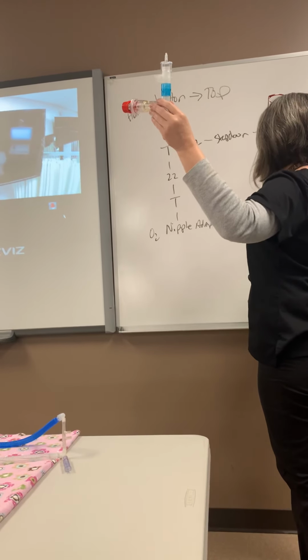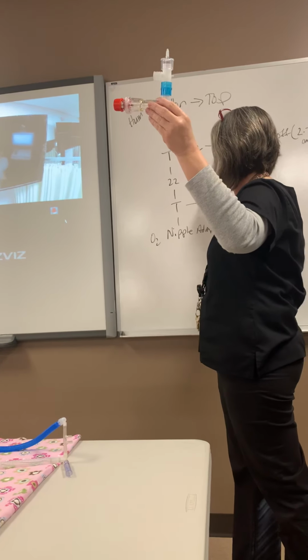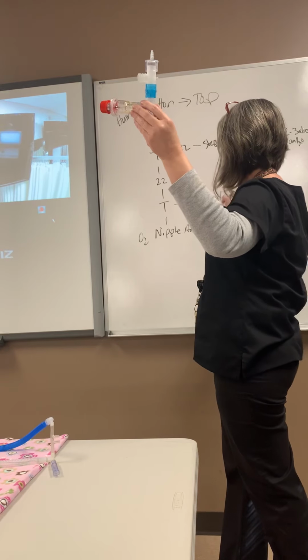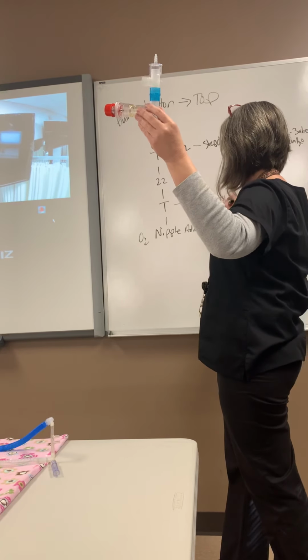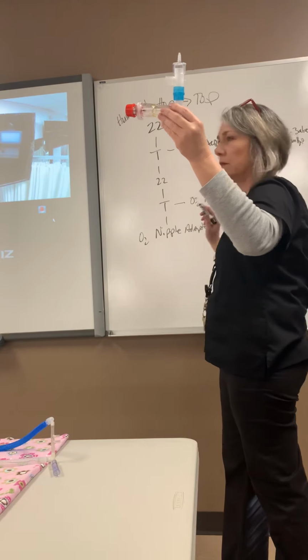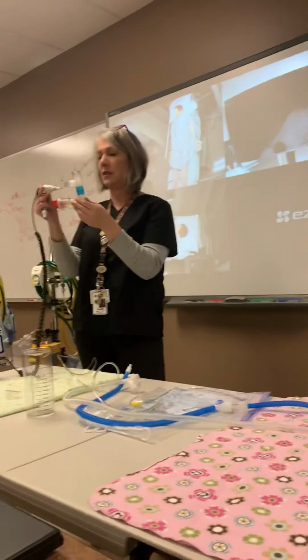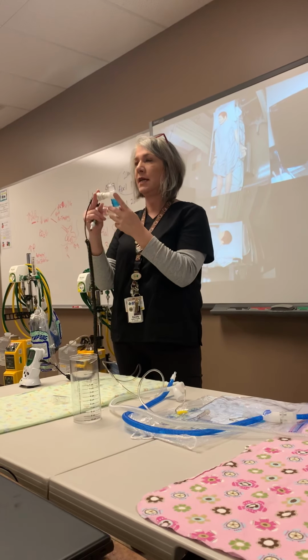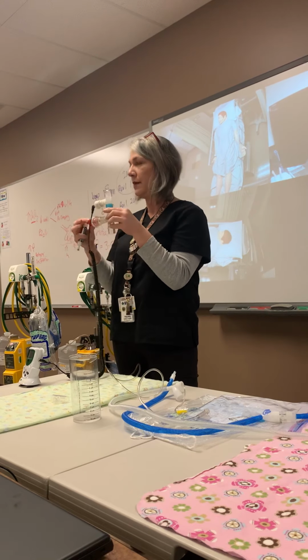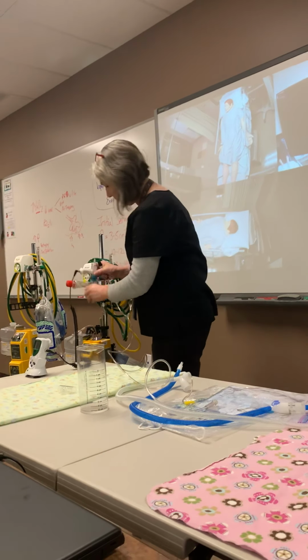So I'm going to do the water, okay? Off this T, the O2 analyzer. Okay, so that goes right here. It doesn't need any special adapter. It fits beautifully in that T-piece mount. There's your tree. That then goes right on here.